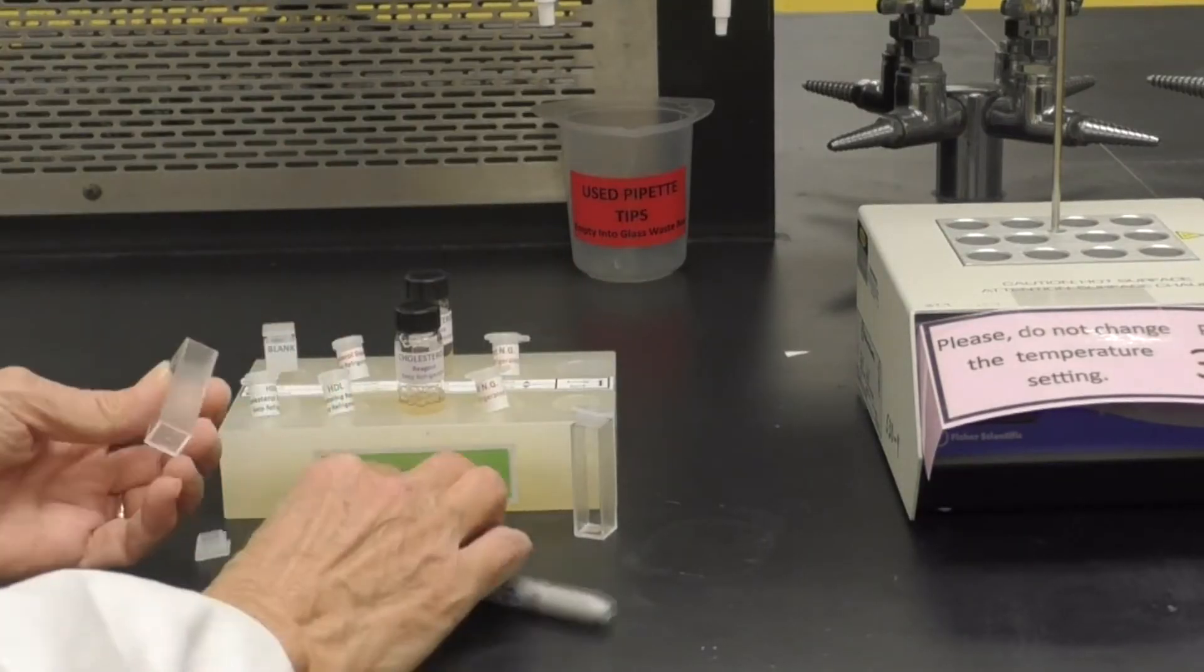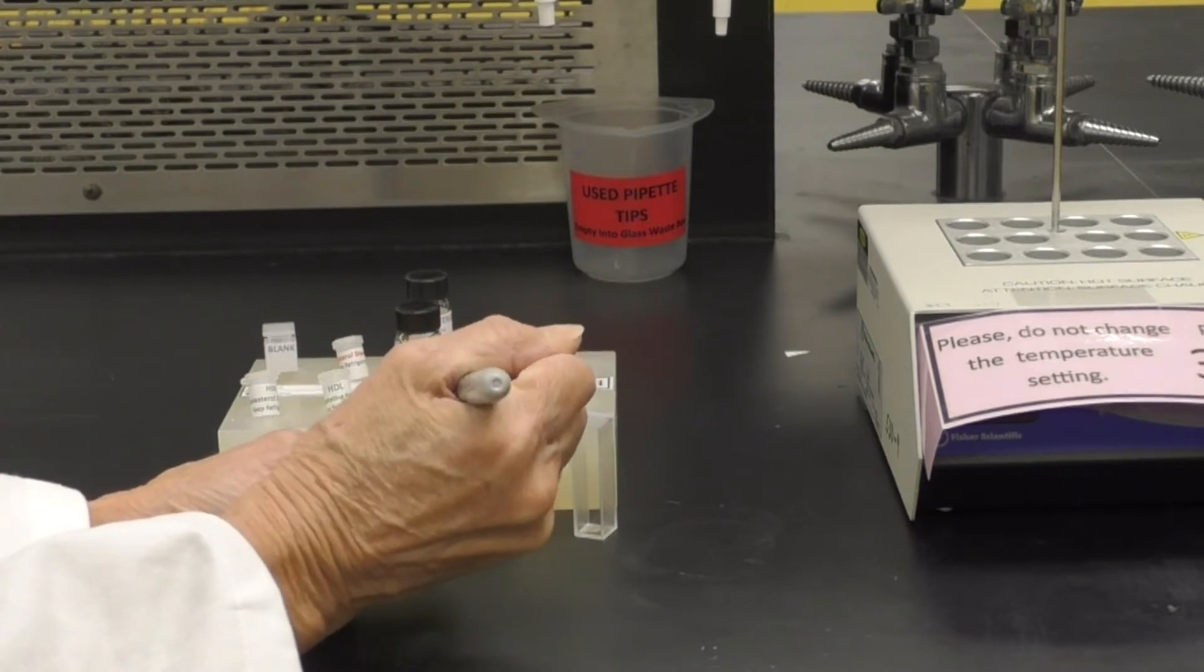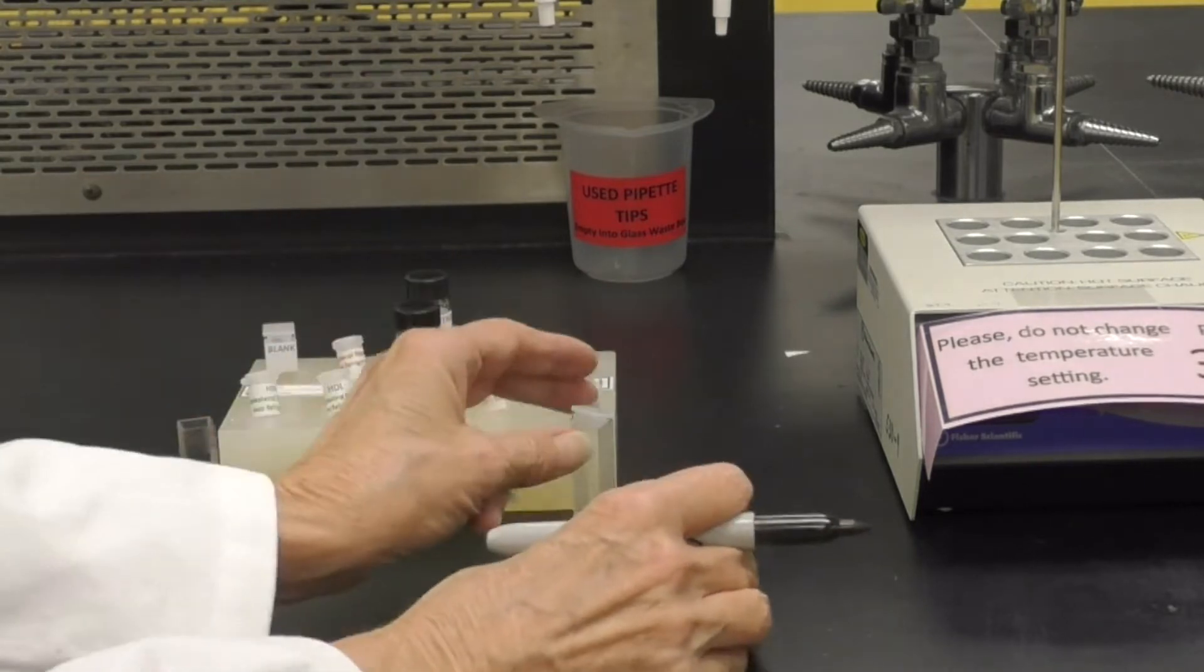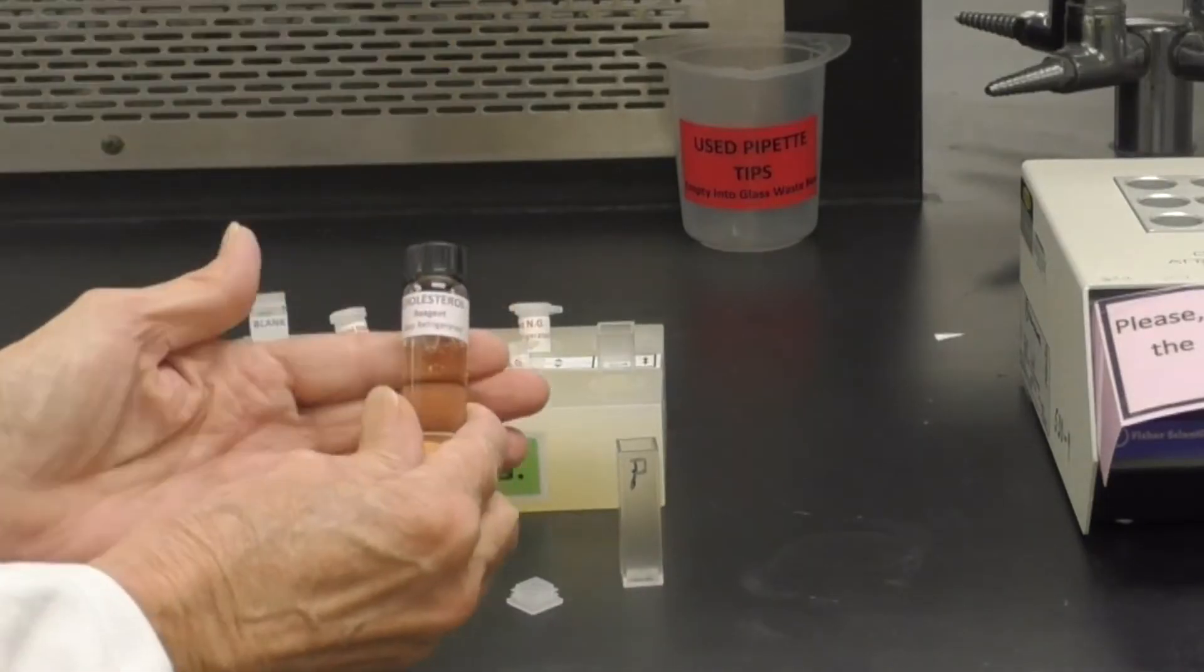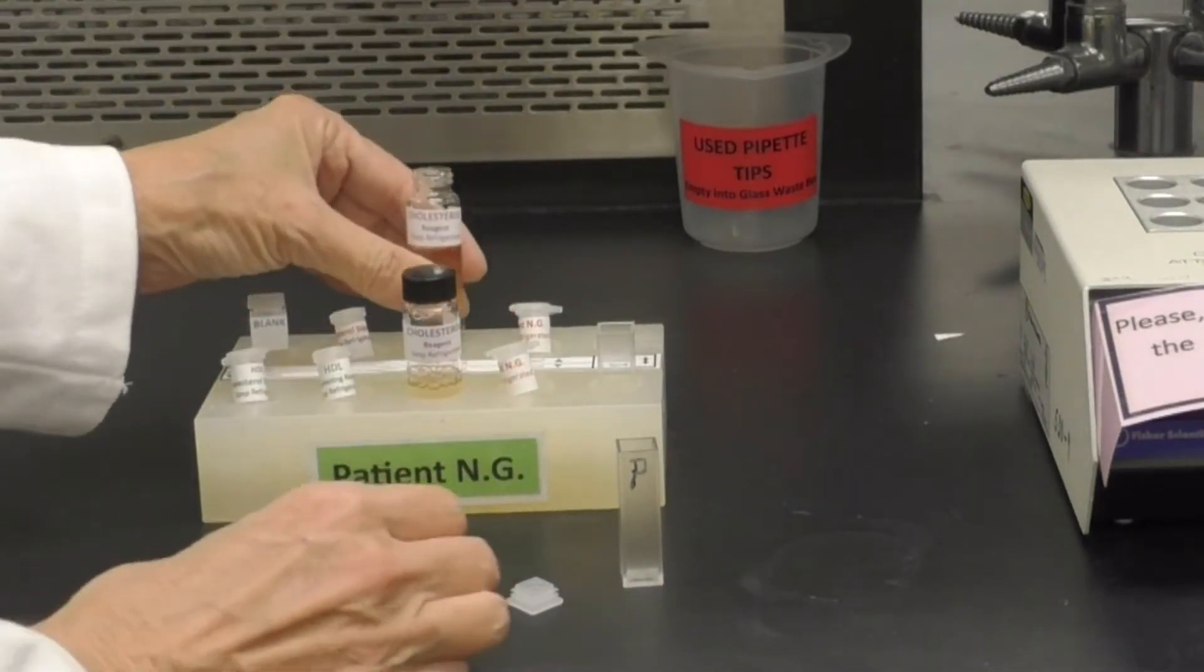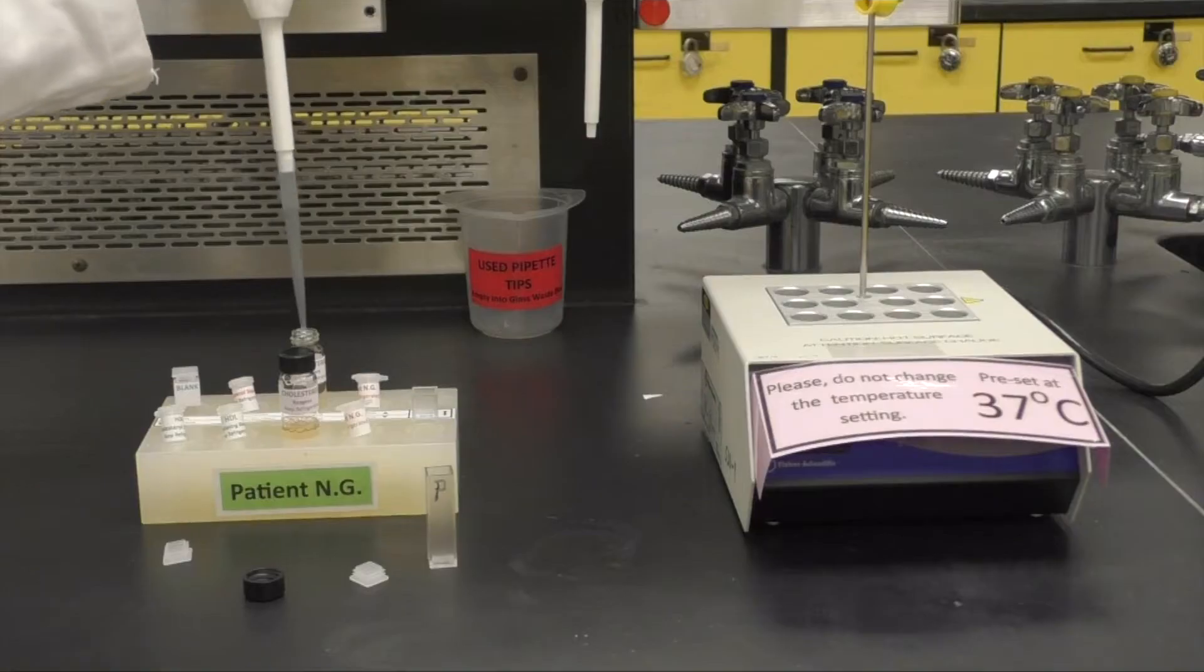To determine your patient's total cholesterol, label two cuvettes. Here we are using the letter P for patient and S for standard. Carefully pipette 2 mL, in other words 2,000 microliters, of the cholesterol reagent into each cuvette.